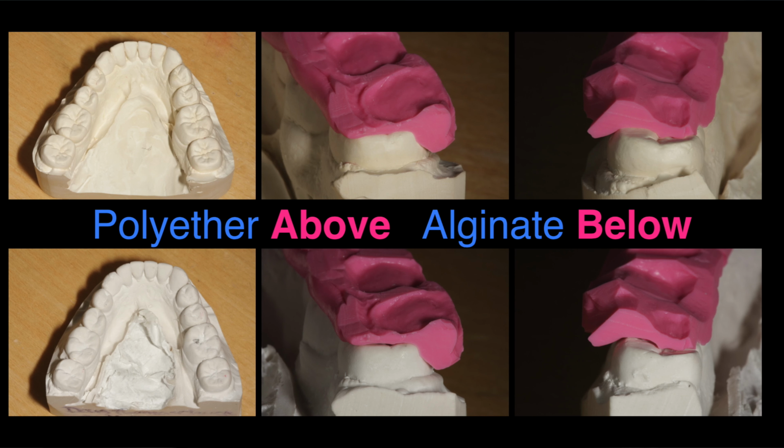You could take an alginate of the provisionals, and for the most part, it's pretty good, but not as good as taking a polyether impression of the provisionals. I've shown that before in some of my webinars. I have a comparison slide between an alginate impression, what the stone model looks like from an alginate impression, and the same case, stone model poured from a polyether impression. We use a bite record to look at the accuracy of each model. There's a big difference with the stone model poured from alginate compared to a stone model poured from a polyether impression of the provisionals. So we want as much precision in the final outcome of the case.